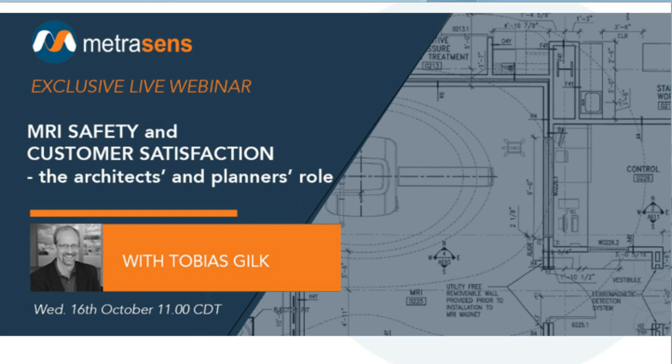And this is where I give a mea culpa. Probably 10, 15 years ago, I was the loudest voice calling for only outswinging doors in MRI rooms. That was based on old MRI door technology and also different interpretations and enforcements of contemporary building codes.